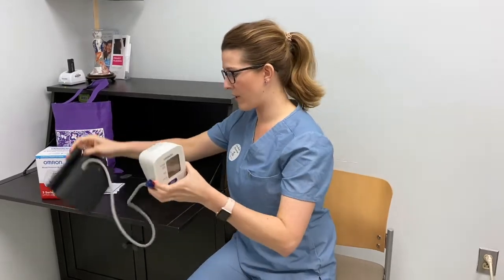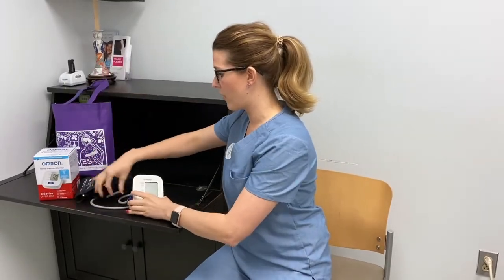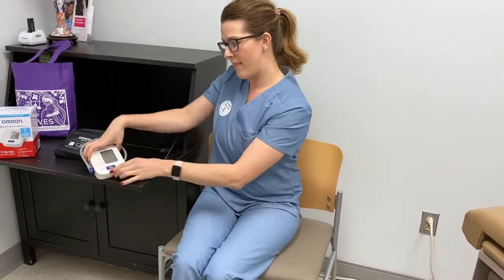When you're taking your blood pressure, there are a few things you want to make sure that you're doing. One is that your feet are flat on the floor. You don't cross your legs or have them propped up. So your feet are flat on the floor, your back supported in your chair, and your arm at table height, which will also be the height of this machine. You don't want this to be a lot higher or a lot lower than your arm. You want your arm and this to be at the same height.